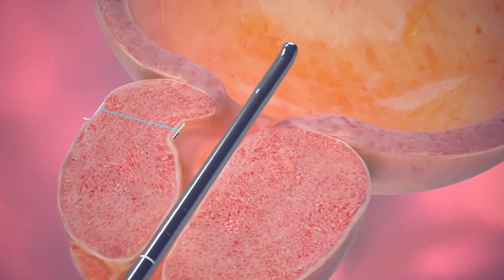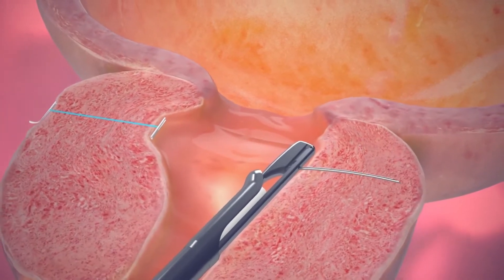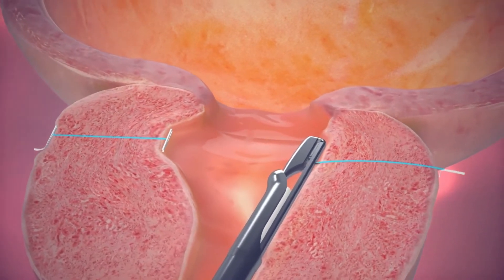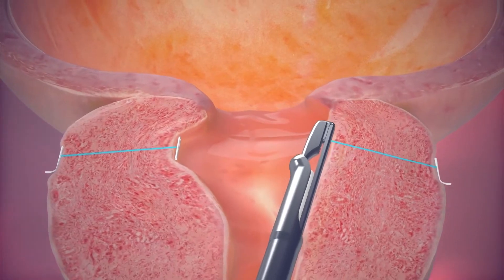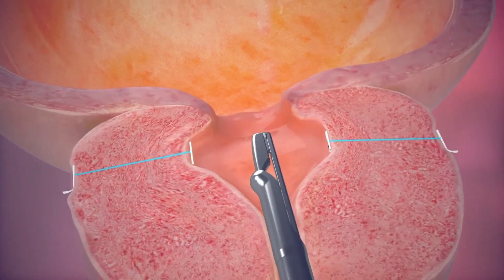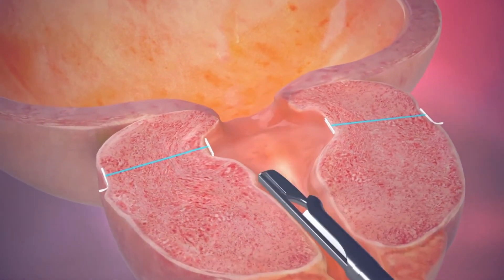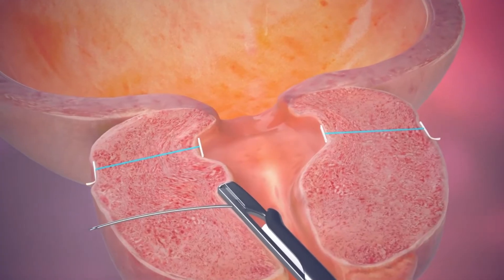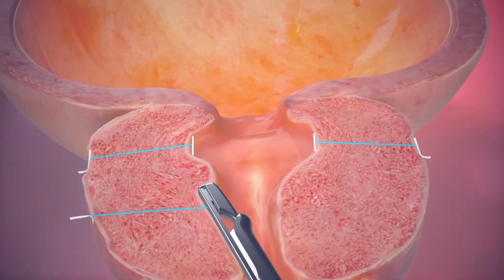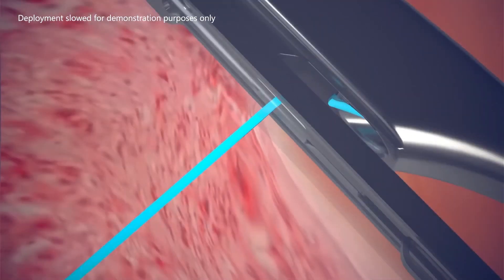Depending on the prostate size and amount of blockage, several more implants may be placed in the same way. Typically, 4 to 6 implants are placed into the prostate. The physician will determine the number of implants needed to obtain an open channel. The outer capsule of the prostate is firm and provides a solid anchor, allowing the implants to lift and hold the enlarged prostate tissue out of the way so it no longer blocks the urethra.